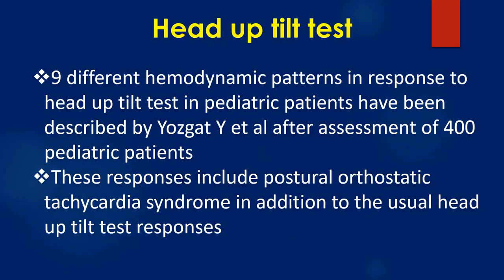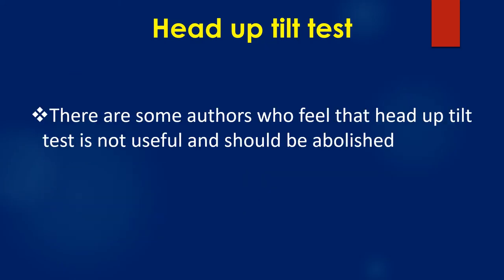9 different hemodynamic patterns in response to head-up tilt test in pediatric patients have been described by Yozgat and associates after assessment of 400 pediatric patients. These responses include postural orthostatic tachycardia syndrome in addition to the usual head-up tilt test responses. There are some authors who feel that head-up tilt test is not useful and should be abolished.